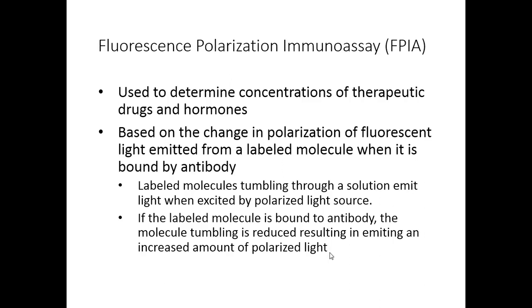It's a competitive assay, so what do we already know about it? We already know that it's going to have an inversely proportional relationship when we're looking at the standard curve, because there's a competition between labeled antigen, fluorescently labeled antigen, with unlabeled antigen from the patient. Based on that, this is a really interesting way that this works.